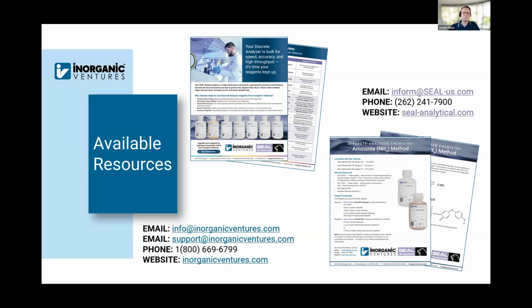Yeah, great point. And then the last question I see here: does the pre-made NEDD turn pink? And if so, would it still be usable if filtered? It does turn pink after nitrite touches it. It might have a slight tinge to it over time, and just like is recommended in our method, you can filter that. That actually creates a pretty big molecule that can usually be filtered out. So absolutely, you can try that if you've had that reagent opened and it's been sitting around for a while and it's just got a little pink tint to it. Just like it says in our method, go ahead and pour that through a tight filter, and then you can use that reagent on the system.